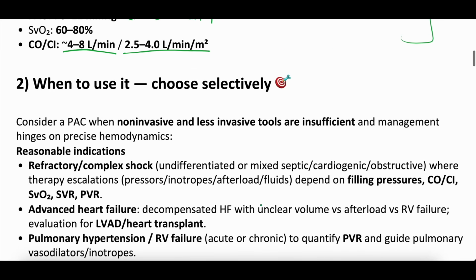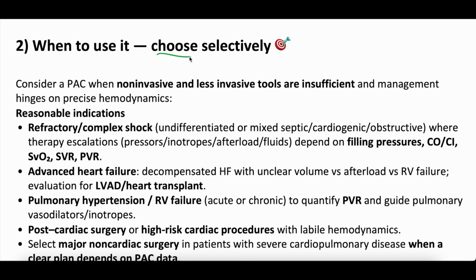All right, so when to use it? Well, we wrote here choose selectively. And we have mixed feelings about this phrase, but the summary here is that, when people have actually studied the use of pulmonary artery catheters, many of the studies have shown no improved outcomes just in all comers. But people who are critical of that, people who are very pro pulmonary artery catheter, would argue that those studies were with folks who maybe didn't know how to use the pulmonary artery catheter most appropriately. But again, choose selectively. There does seem to be patient populations that benefit more than others, okay?